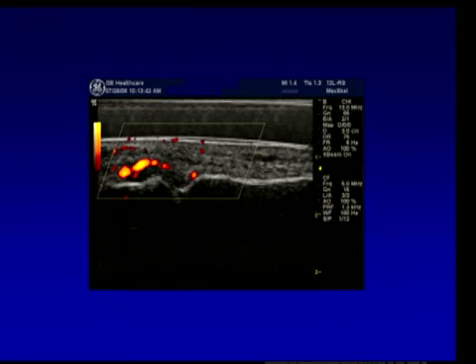And if we take a look at that, you see again here the skin, you see the joint, and then you also see all this increased blood flow over the surface of that joint that represents all the inflammation and the thickened synovium. We actually can measure the thickness of that synovium and actually can remove the fluid that we see here represented by this hypoechoic or anechoic pocket.